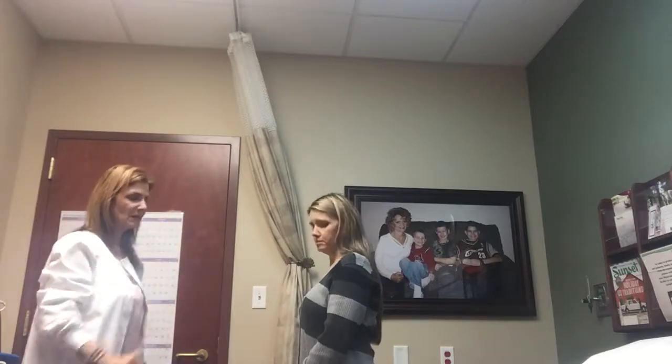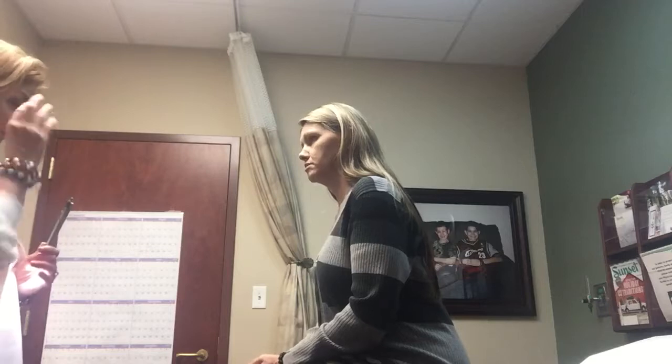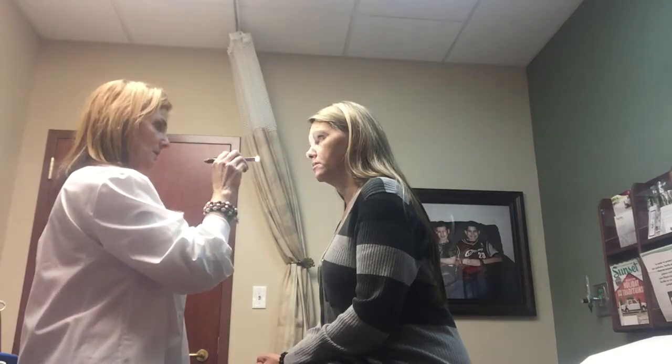Perfect. Okay, you just want to have a seat. And while I'm checking all of the muscles in your eye, I'm going to go ahead and shine a light in your eye and look at the pupils to check the muscles and the movement of the muscles of the pupils to make sure that they're working properly too. So I'm just going to shine this light in your eye. I just want you to look straight ahead at me. It's going to be bright. Good. And what I'm checking for is called PERRLA, and what that stands for is the pupils are equal and reactive to light and accommodation, and you did that perfectly well.